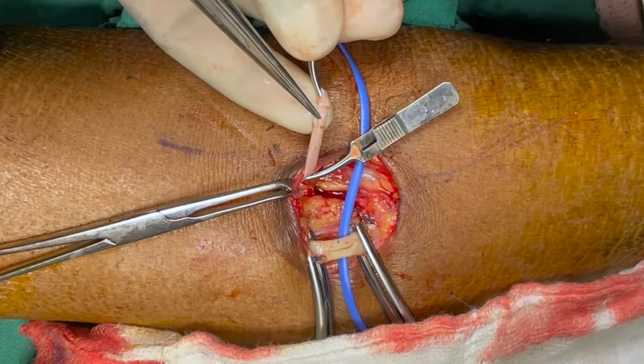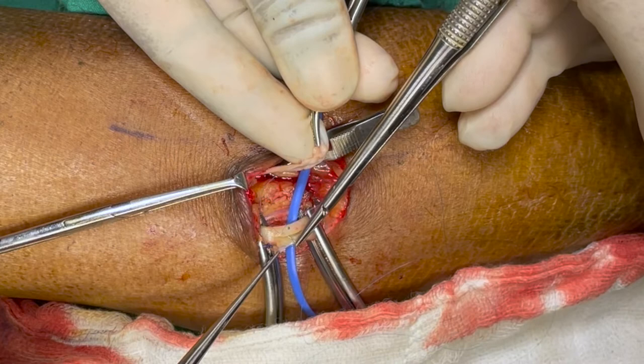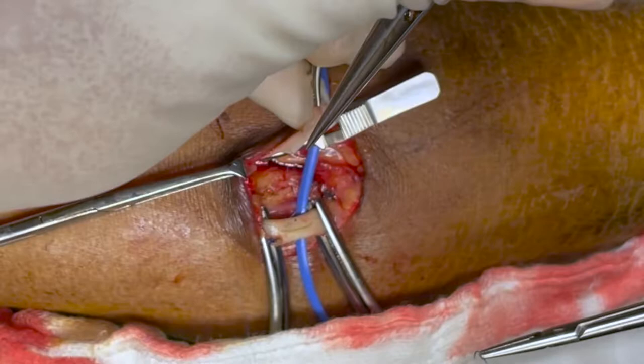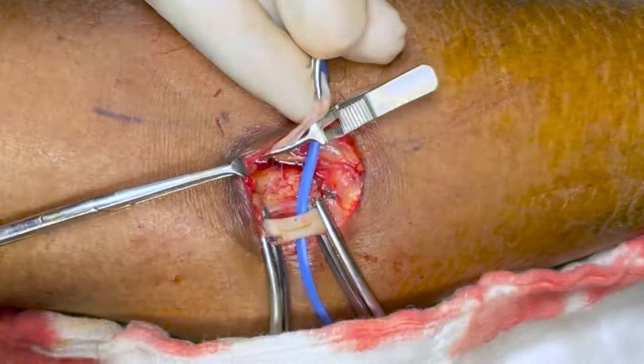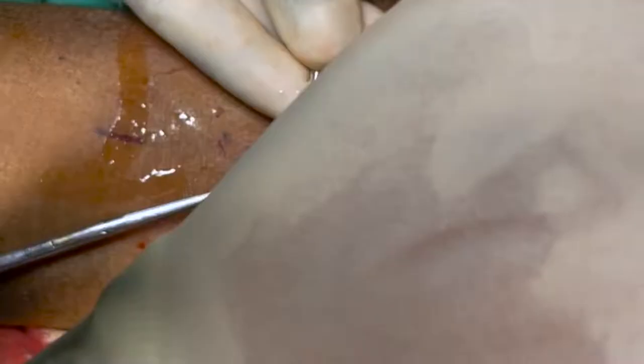We take the first stitch from the artery just near the heel, from inside to outside, then from the vein from outside to inside. There are many ways of performing a parachute anastomosis. The technique we are doing is 4 or 5 heel stitches, then continuing with the same needle for the further anastomosis.